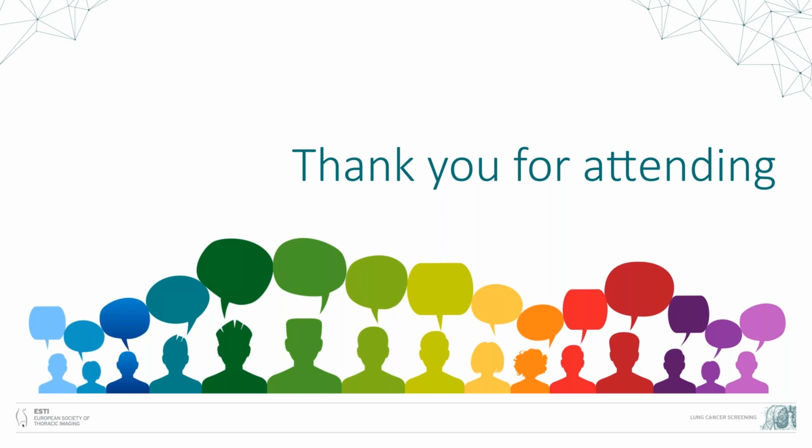Congratulations, Annemiek. It was very interesting and clear, and important that you indicate all these requirements. You mentioned that our colleague from the UK performed some research to compare the performance between technologists and radiologists. Can you tell us more about it? I think they compared technologists or radiographers as having the first read, not replacing the radiologist, but there might be a role in pre-reading the examinations, and then have some of the examinations go to the radiologist so that the workload isn't that high.